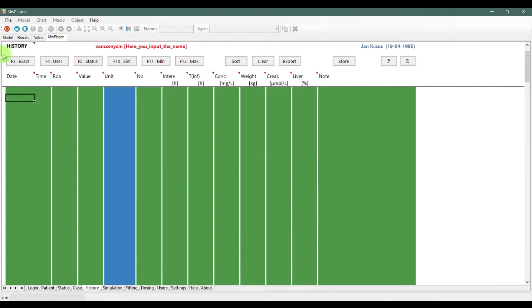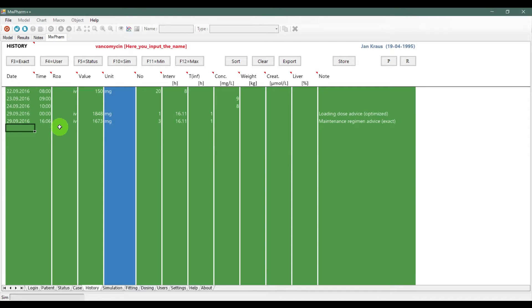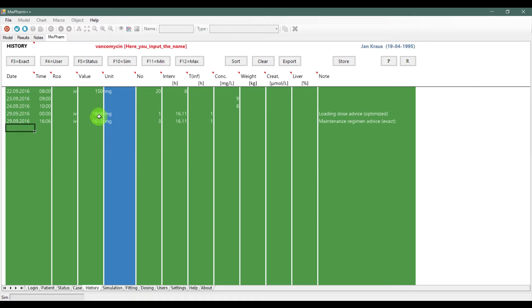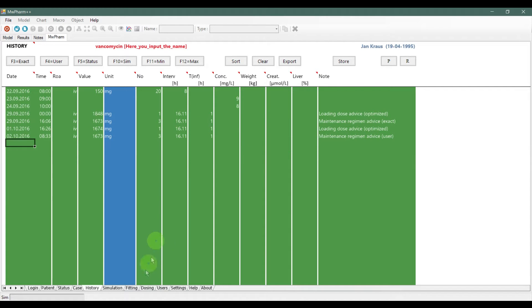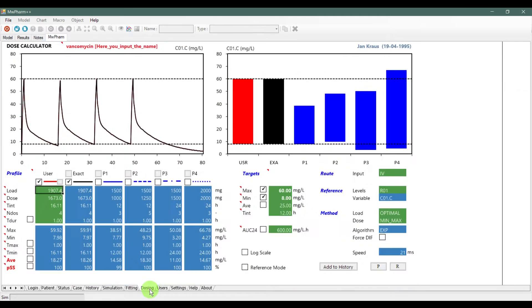In the history tab, you also have a few buttons with various functions. The exact button will input the exact doses that are calculated from the Cmin and Cmax parameters. The user button will do the same, but you can change the user settings in the dosing tab.